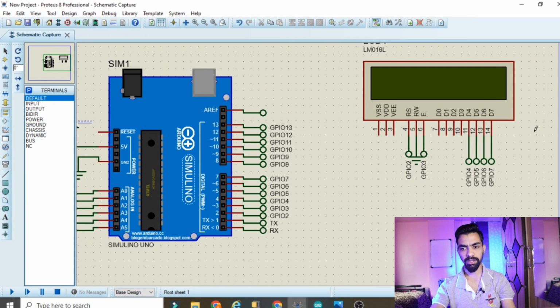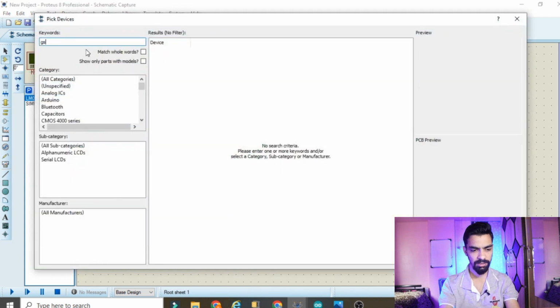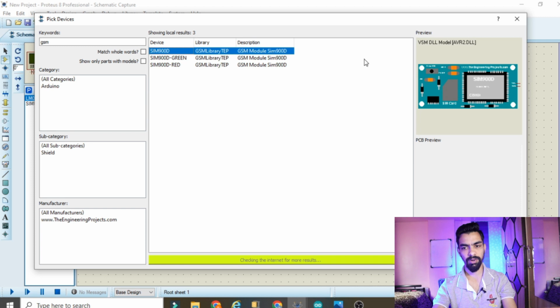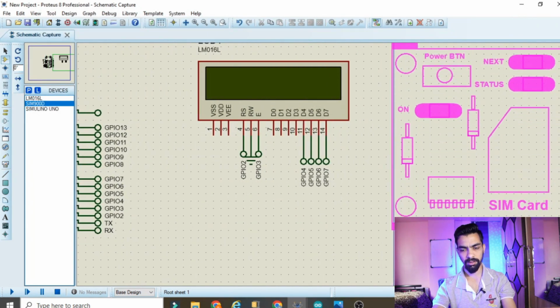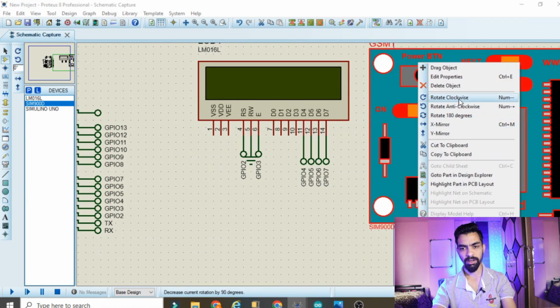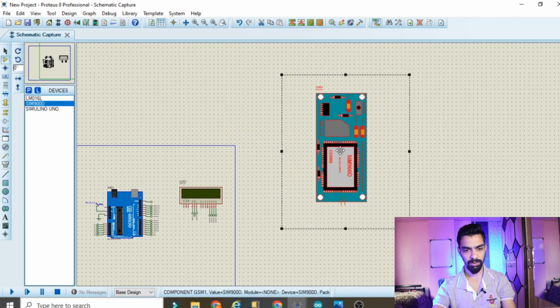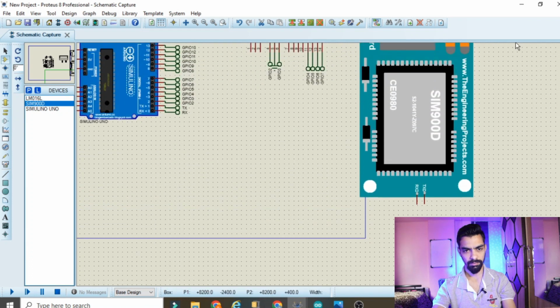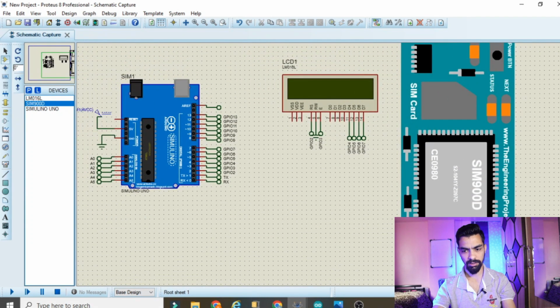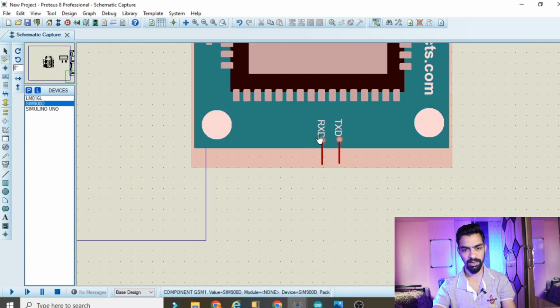Okay, after that we will connect the GSM module with the Arduino. So how to connect the GSM module? I will tell you. Just go to the component mode, then again click on P and type here GSM. Once you type GSM, you will find SIM900D. Click on OK and place that GSM here. Right click on the GSM, rotate anti-clockwise. So the GSM will become here. Just shift here. Okay, like this.